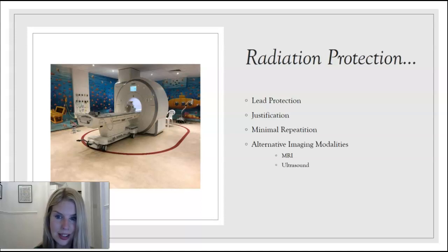So, has the clinician provided rationale for this x-ray? And it could be sometimes that they'll ask for things that aren't appropriate. So they'll ask for a scaphoid x-ray in a child who doesn't yet have a scaphoid. So things like that you have to be very careful of.